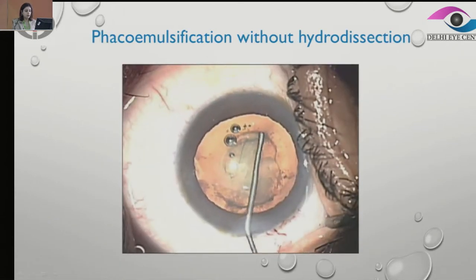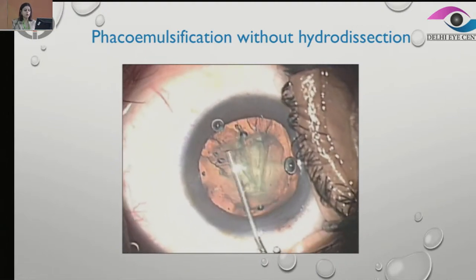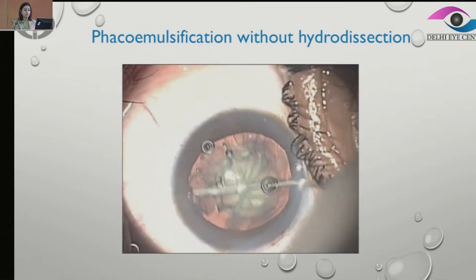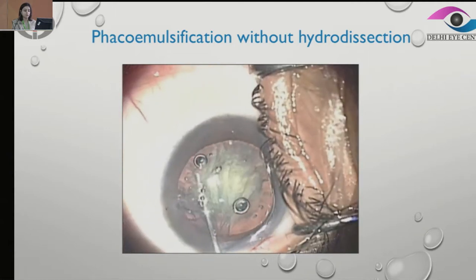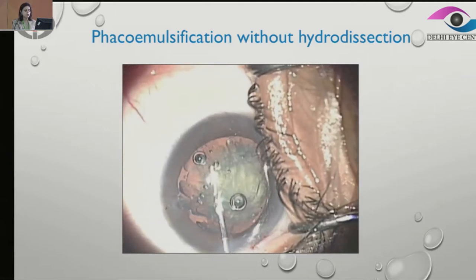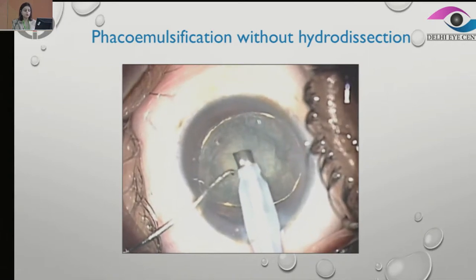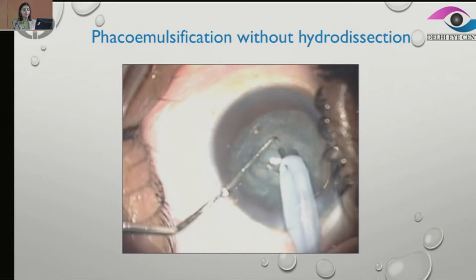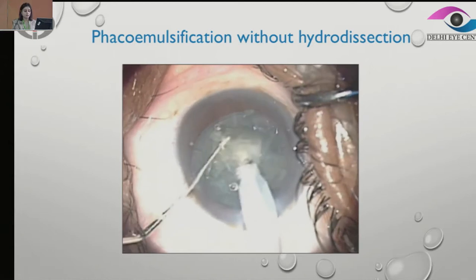I'll just demonstrate this technique of how to use the viscoelastic. Here we are going in beneath the anterior capsule with a viscoelastic cannula and making sure that we separate the cortex from the anterior capsule, gently putting in some viscoelastic. Then do a good hydrodelineation so that it's easier, and go ahead with the trenching. Here, without rotation, we are dividing into two and picking up each piece, not rotating the nucleus much, and then we emulsify.